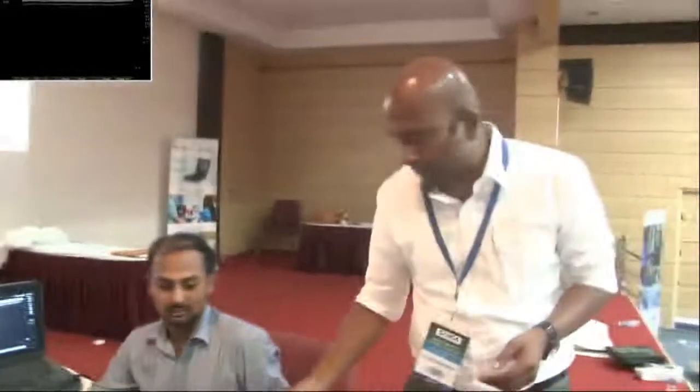So I hope all of you have seen this in the individual stations. There are different ways of doing a particular thing. This is one of the ways that you can see and enjoy the process. With me, Dr. Shajish is there to show you the structures on the screen. If you have any doubt, you can interrupt me in between. So let me start with the brachial plexus.